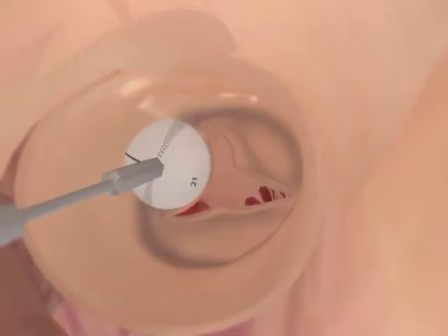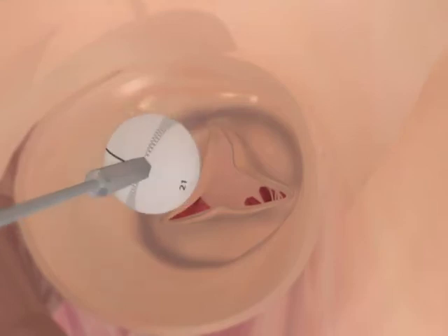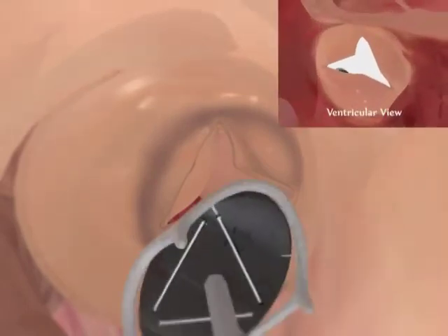The HAART technology includes an instrument for selecting an appropriate aortic repair ring. After aortic valve exposure, the sizer ball is placed behind the right coronary leaflet. The length of the free margin is evaluated such that the leaflet insertion into the aortic wall falls within the area of crosshatch marks on the sizer ball. This provides the proper size of the device to be implanted.